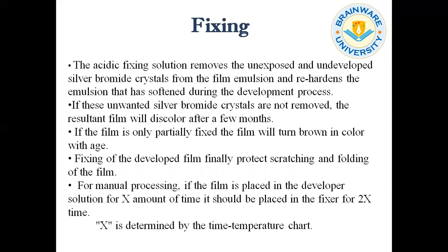That means if we are developing a film for 5 minutes, then we should fix the film for 10 minutes and wash the film for 15 minutes. And that x is determined by the time temperature chart, again provided by the manufacturer.